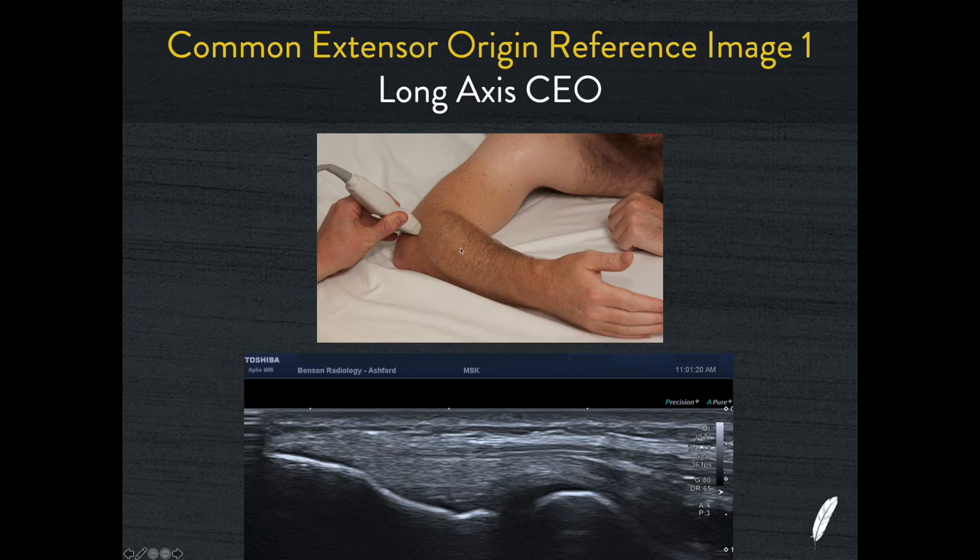This is the way I set up the patient: sitting opposite me with the elbow flexed at 90 degrees and their thumb pointing towards the roof. I place the proximal end of the transducer on the lateral epicondyle and point the distal end roughly towards compartment two of the wrist — just slightly to the radial side of Lister's tubercle — to line up with that compartment two apparatus. The resultant image shows the lateral epicondyle, the radial head, a deep layer of collagen representing the joint capsule, radial collateral ligament and annular ligament. The superficial fibres have their own origin — this is the extensor digitorum communis component — and between these structures is what we hope will be extensor carpi radialis brevis. However with the radial head visible this is actually a hybridisation of the other components of the common extensor origin.